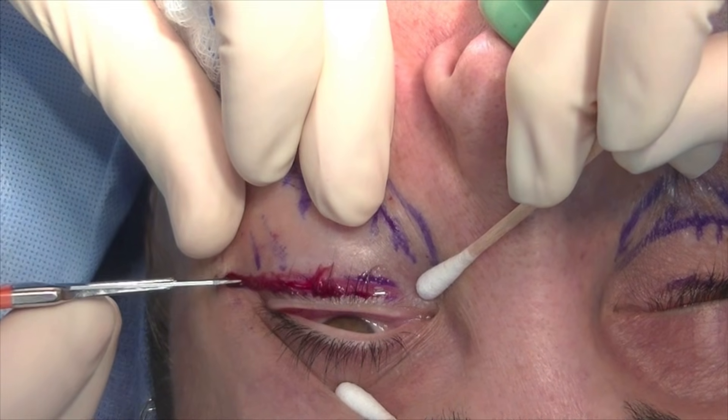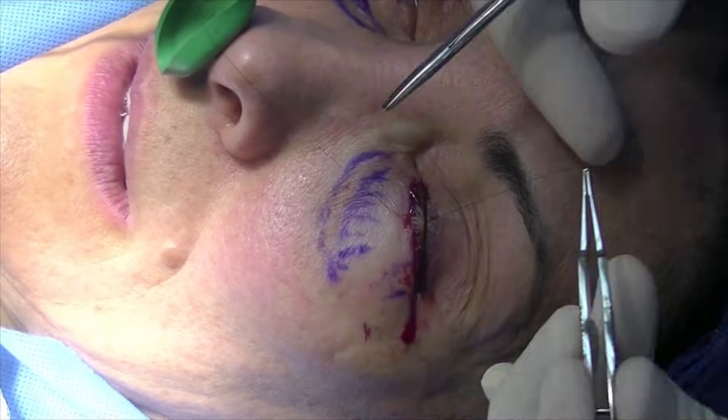A standard subciliary incision is made and extended past the lateral canthus. The lower eyelid is suspended with a 6-0 nylon suture.